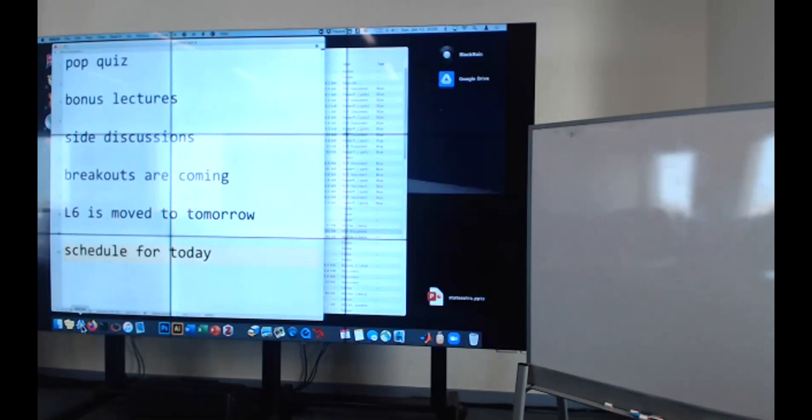So there's a term, the definition is a lack of signal in an MR image due to spin dephasing caused by magnetic field inhomogeneity. What is this called? Okay, go ahead. Dropout. Yep, signal dropout, and it shows up as little holes in the image, or just dark spots in the image. Okay, next question.